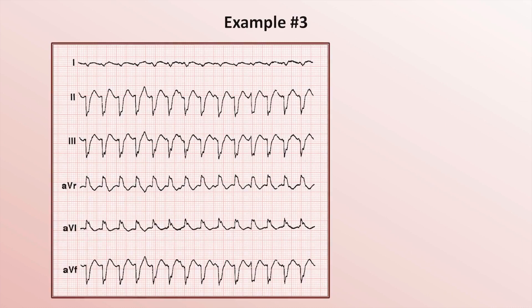Example 3. You'll notice the arrangement of leads is different here than in a standard 12-lead EKG. You could refer to this as a 6-lead rhythm strip, but the steps to assessing the rhythm are the same. Estimation of the heart rate is tricky because we can't use the 10-second rule since the strip is not 10 seconds long.